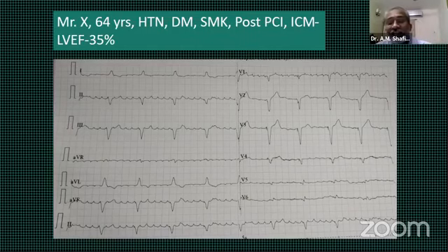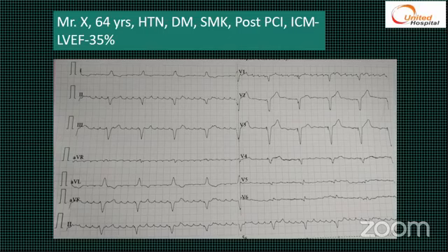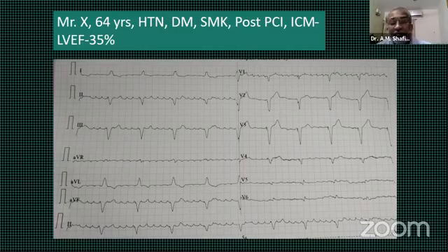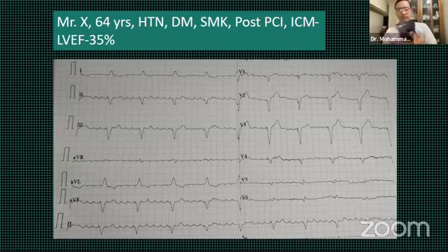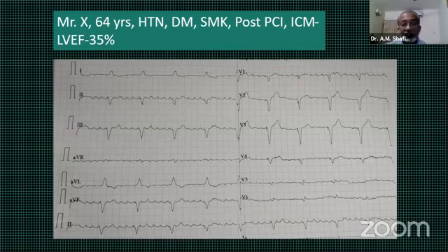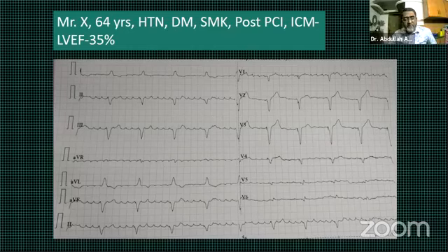And is there anything else? There's no synchrony between the atrial and ventricular activity. So the rhythm looks regular, right? Concentrate on the isoelectric line. What do you find? What about the isoelectric line? Is it flat or is there something?